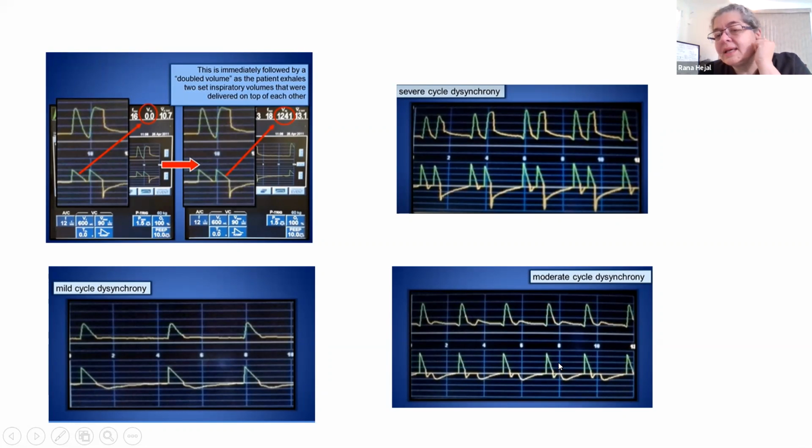When this happens, the amount of support that the ventilator is giving becomes less. If you look at the support that this ventilator is giving, it's not as good of a square wave as it's supposed to be. Instead of it being like this, it has been hindered to perhaps nothing. The patient's work of breathing is much harder, and the support from the ventilator is less, and these people go into fatigue and end up with an inability to come off the ventilator later on.